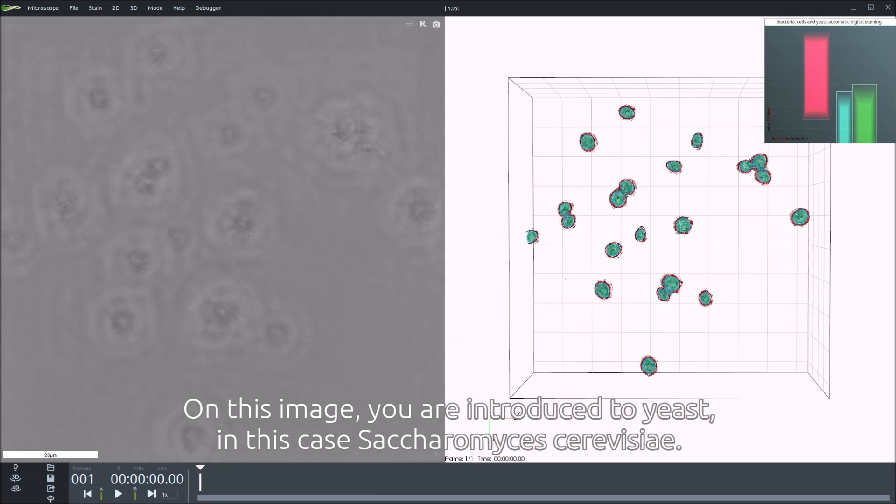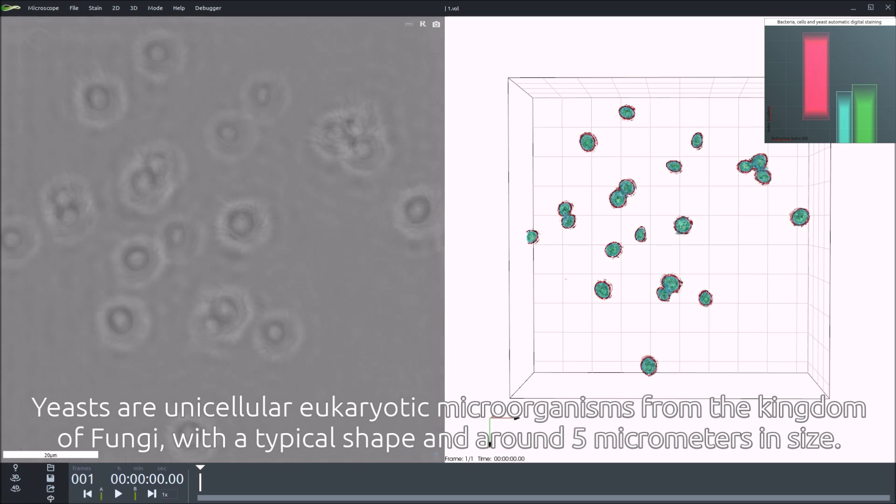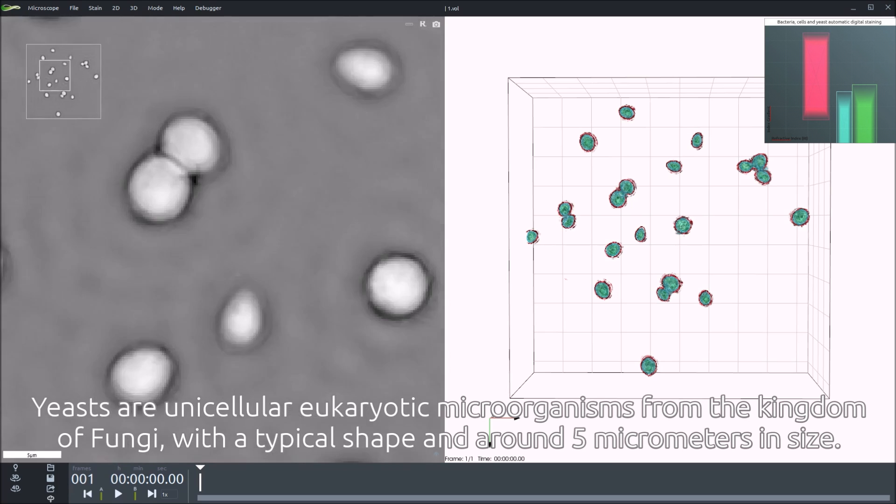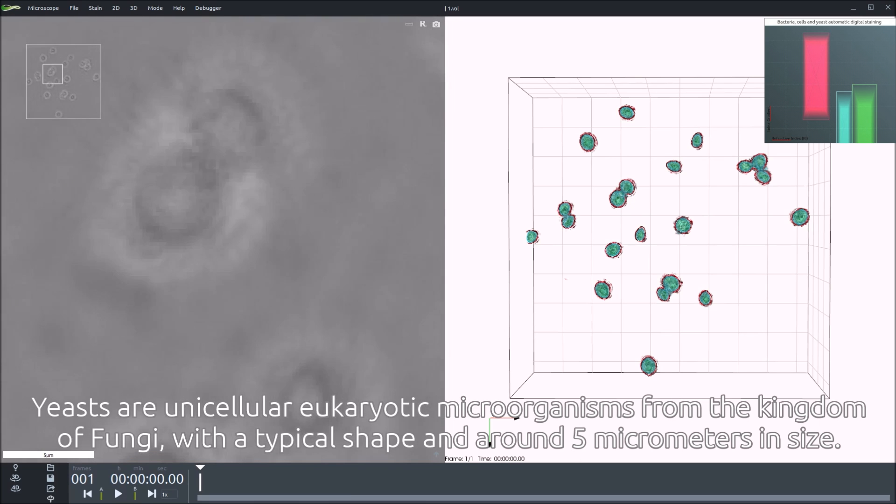On this image, you are introduced to yeast, in this case Saccharomyces cerevisiae. Yeasts are unicellular eukaryotic microorganisms from the kingdom of fungi with a typical shape and around 5 micrometers in size.